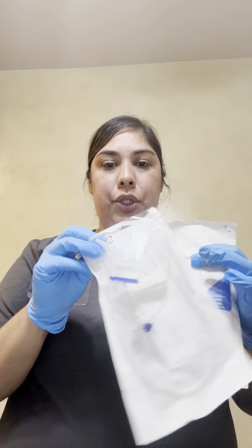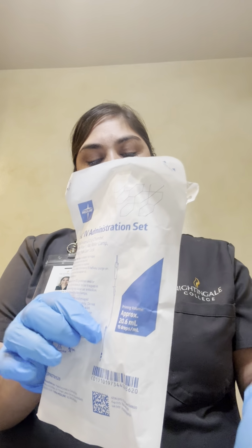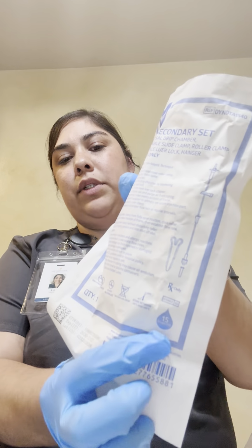I have two, one for the fluid, one for the medication. They both have 15 drops per ml. And on the second bag, 15 drops per ml. These are tampered with because of how many times I've been doing these videos, but normally you would make sure that they're not tampered with before even grabbing these.